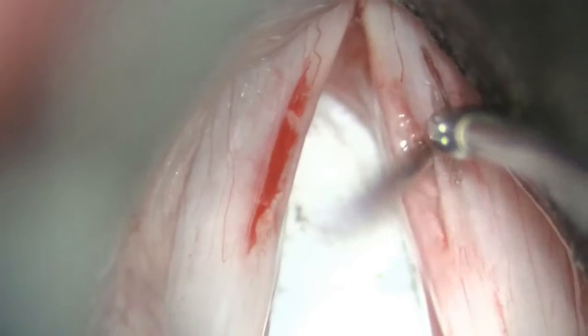Once the pocket is created to be slightly larger than the sulcus itself, a ruler is used as a template to size the temporalis fascia graft. The temporalis fascia is harvested, dried, and pressed as you would for a tympanoplasty.